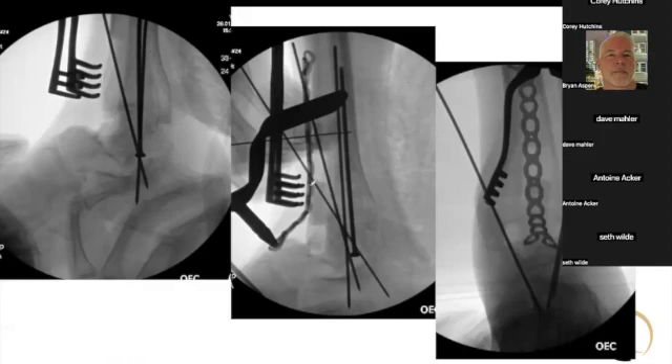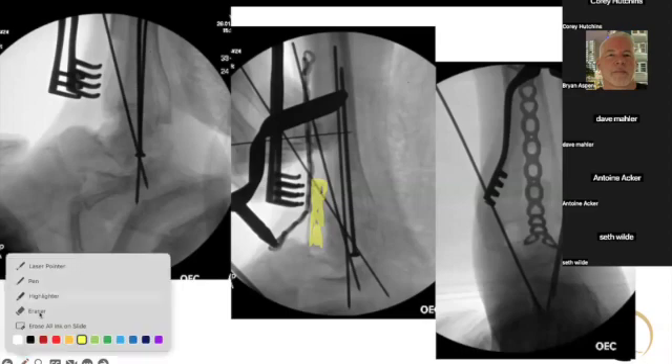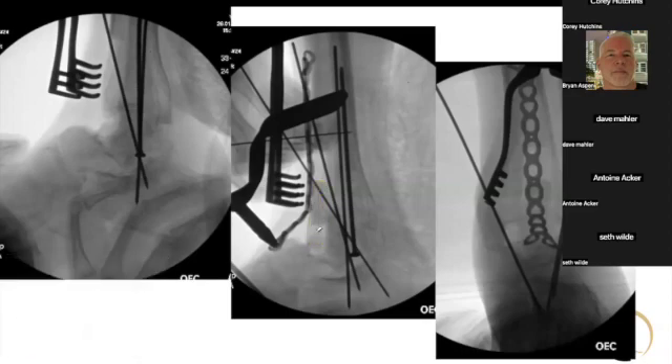What she's saying is: this front of the tibia — she did a corticotomy and slid it distally down into this area to make up and take up that bone space. When doing that, the posterior part is provisionally fixed with Steinman pins. He did have a portion of medial or lateral talus that they were able to use and put up into the tibia to get the alignment needed and fill the void.